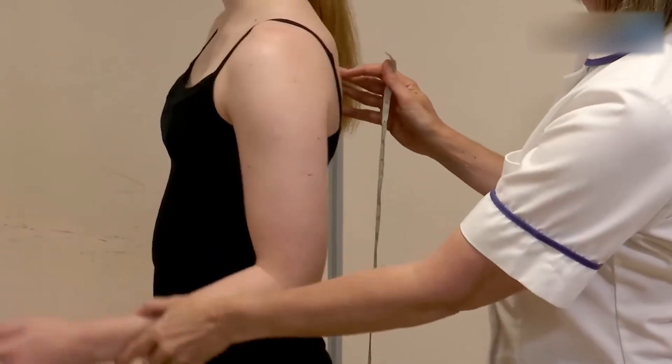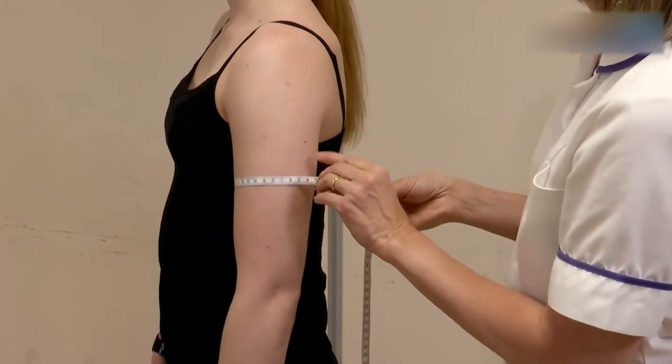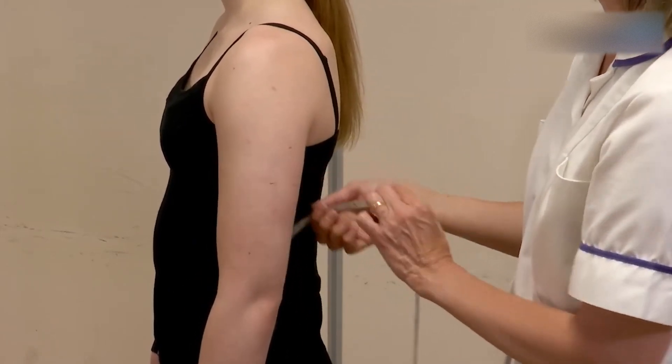Now ask the individual to hang their arm loose and measure around the midpoint of the arm to the nearest millimetre. Ensure that the tape is snug but not too tight or too loose.